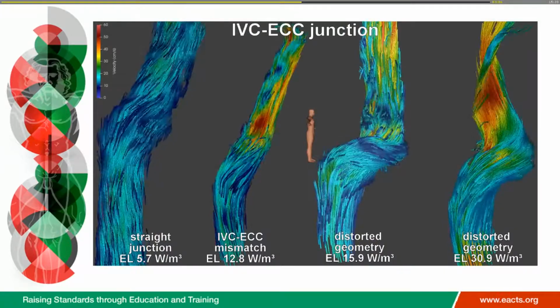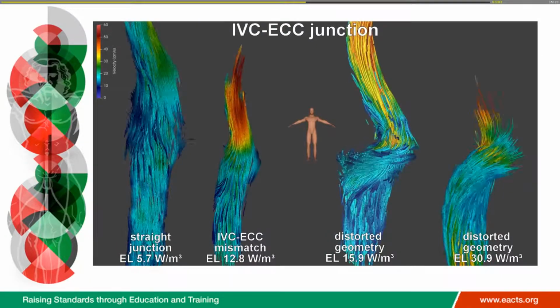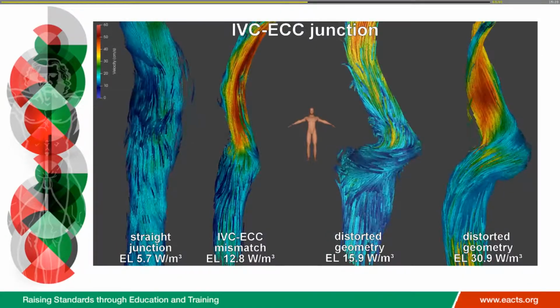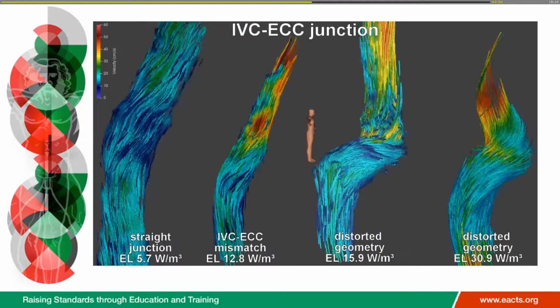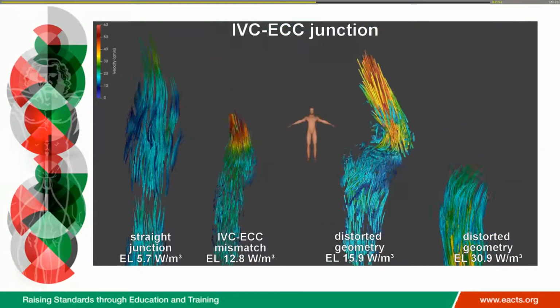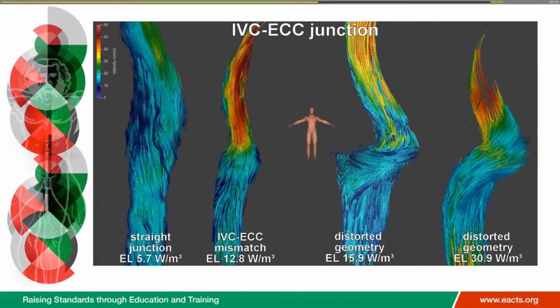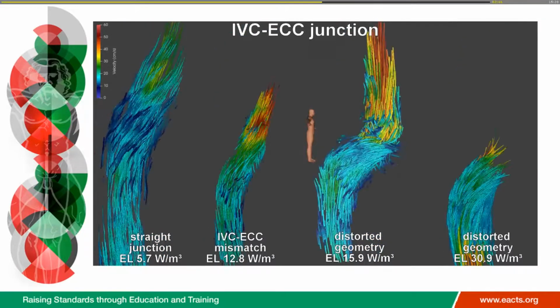What do you think about it? Yeah, that's difficult because these were all randomly selected patients, so none of these patients received the MRI for clinical indications. It was the 4D-flow MRI for research purposes when they also had the MRI for normal follow-up. So these patients were essentially asymptomatic.